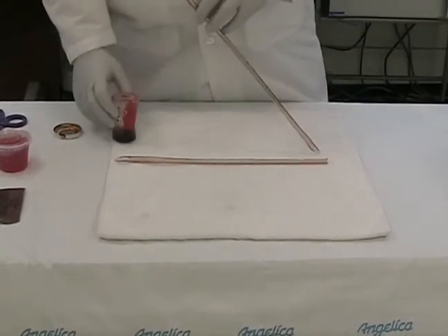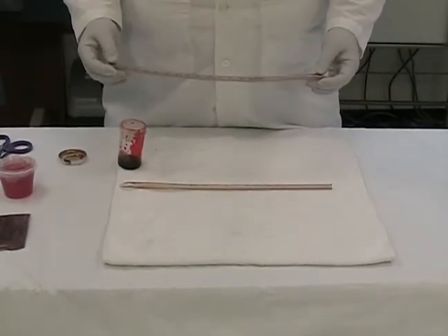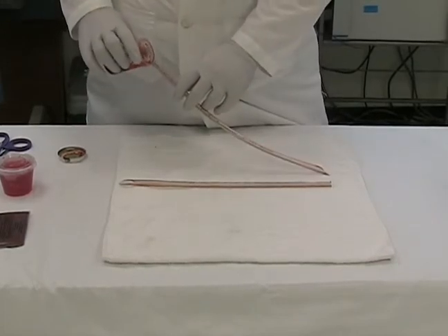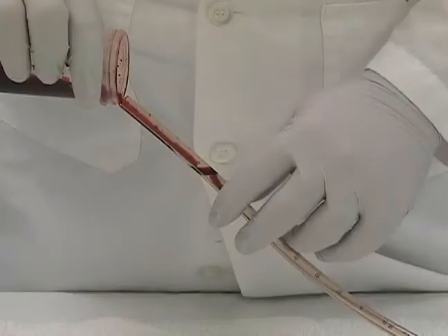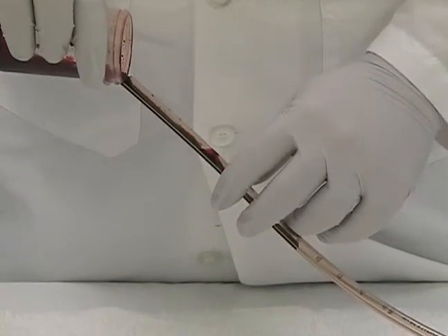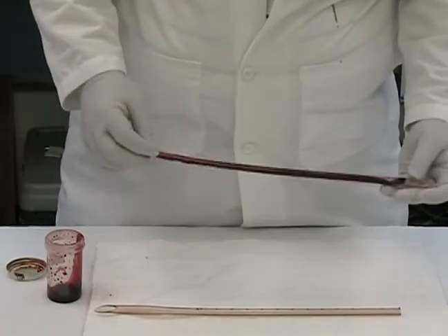We're going to simulate the appearance of having blood dried in the chest tube. So we take our simulated blood, and we pour the desired amount into the chest tube. Once you have an adequate amount of blood, take the tube between your fingers and roll it back and forth to give it an even coating.